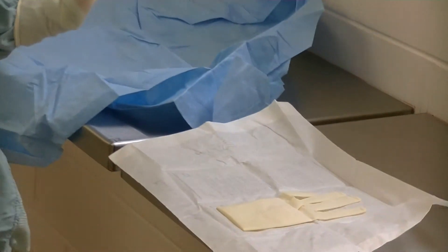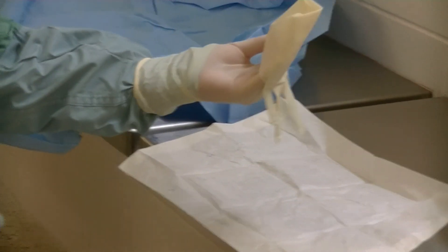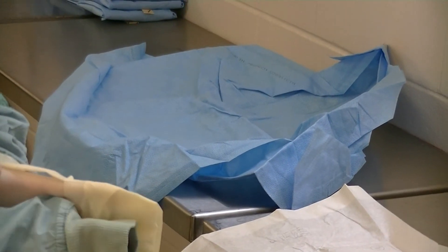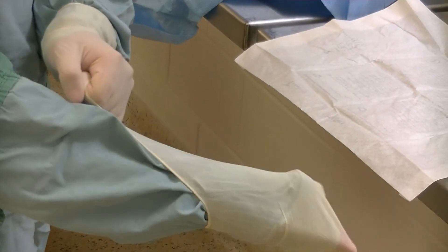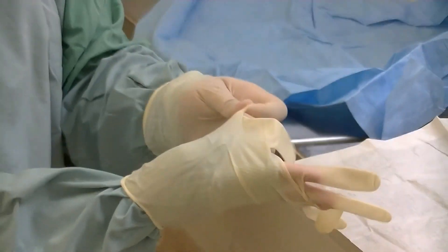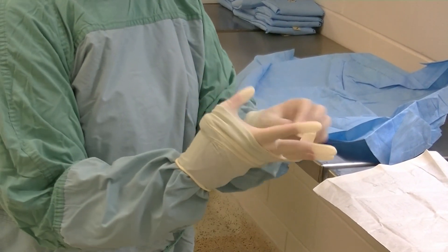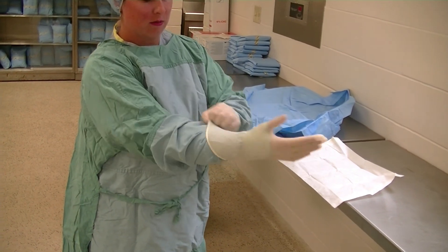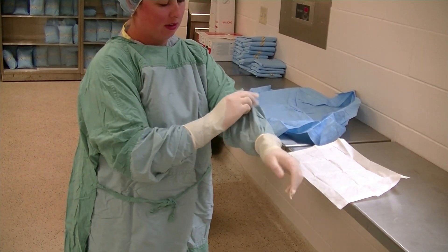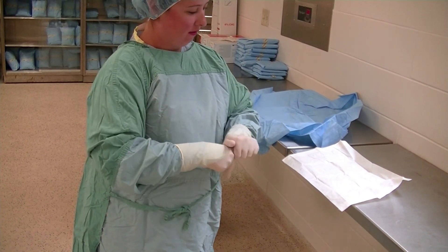Adjust your hand — this gloved hand can now touch the entire glove. Tuck your finger into the cuff pocket on the right side, place the thumb in the same position, put it down on this hand, grab the edge, and pull the glove over. Your gloved hands should never touch the cuffs of the gown, even though it's a challenge to get small gloves over a large gown cuff. Adjust your sleeve so the cuff of your glove is over the cuff of your gown at all times, and adjust your fingers as needed.